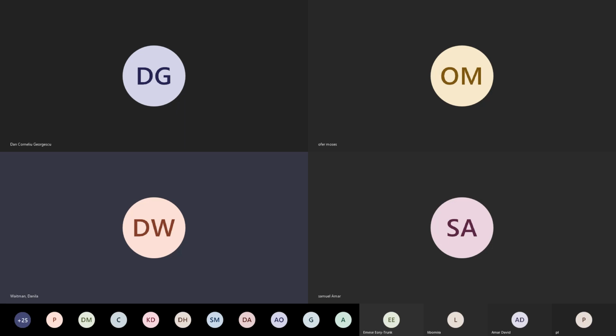Regarding bone width, you need to have at least 3 millimeters in order to use a piezo. There is another tool called magnetic mallet, where 2 millimeters is the minimum that you can use.